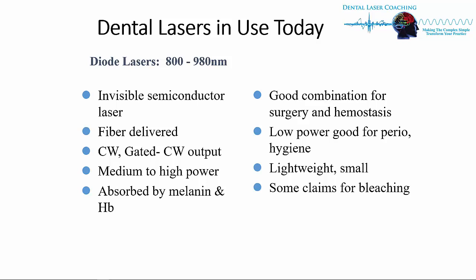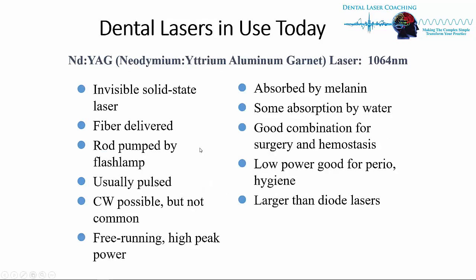It's lightweight, they're small, and we can even do some bleaching with it. The ND YAGs have been around for a while. Again, this is 1064. It's a solid state. It's a more complex mechanism than the diodes. Again, delivered by a fiber like the diode, but pumped, and the energy is released very differently. It's usually pulsed. Continuous wave is possible, but not as common.